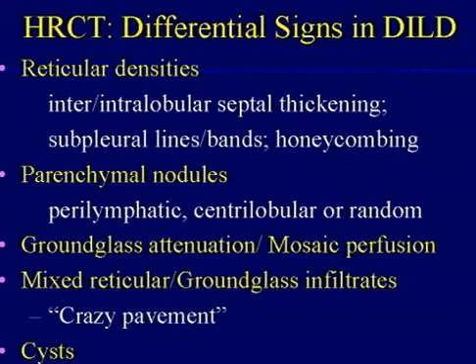And then as a routine, we reconstruct 5 millimeter thick sections using both edge-enhancing bone window, lung window. We use the thinnest collimation possible, and then we reconstruct 3, because most manufacturers allow you automatically to reconstruct 3 separate prospective series. So we do 5 millimeter thick sections with lung windows, 5 millimeter thick sections with mediastinal windows, but then we routinely also do 1 millimeter thick sections every 10 millimeters. That has the effect essentially of turning every study into a potential high-resolution CT study.